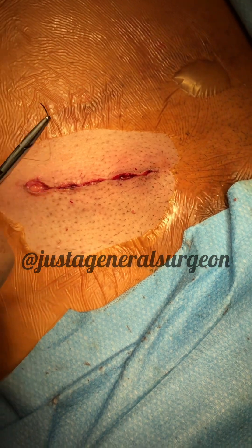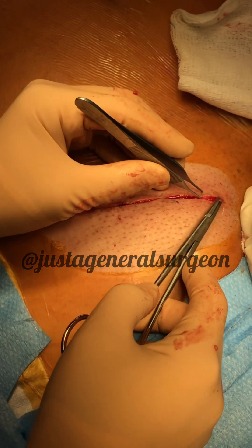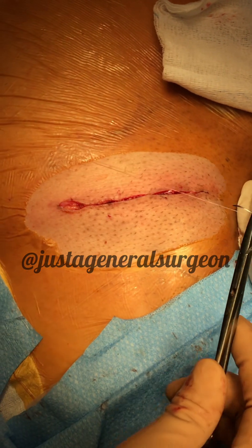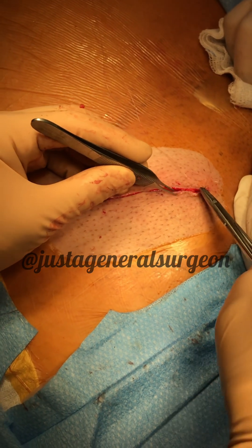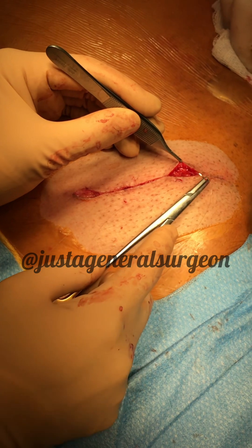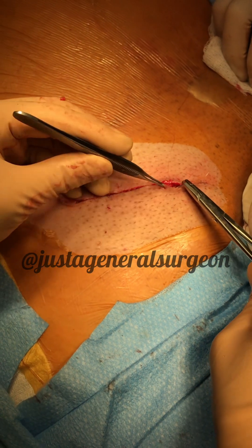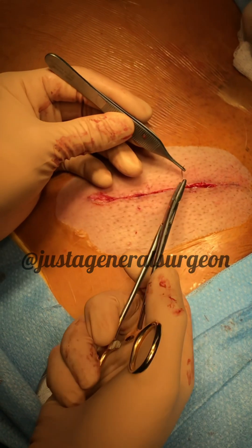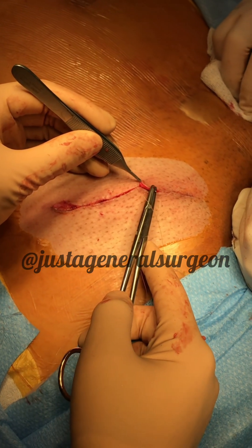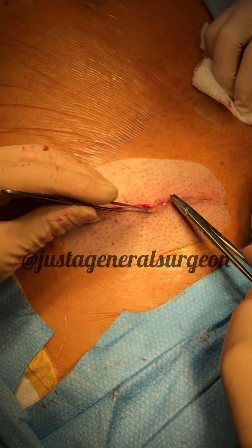I like to take small bites at the corner and then get more aggressive later. I'll have my assistant pull to get some tension so I can see where to go. A lot of techniques you can use to become more efficient, such as loading the needle here and getting ready to go for the next throw right away. Always pull tension so you're not loose anywhere and don't have a big gaping hole when you're done.